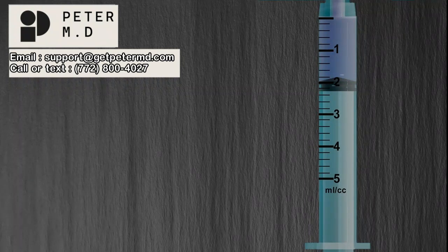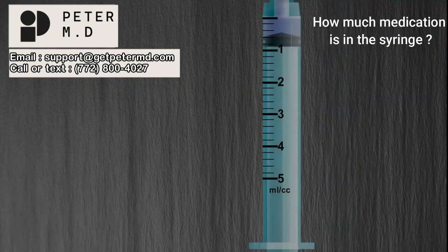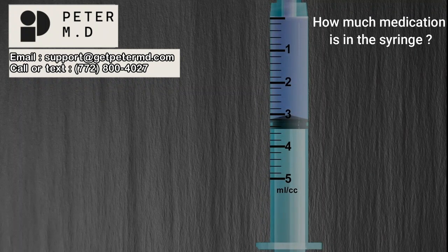When observing the stopper, you will notice that there is a bit of a cone shape at the tip. Ignore the cone-shaped area and measure the amount of medication by focusing only on the top ring of the stopper. For example, notice the top ring highlighted in red is touching the 2 milliliter line — this indicates that the syringe contains 2 milliliters of medication. How much medication is in this syringe? If you stated 0.6 milliliters, you are correct. One more — if you stated 3.2 milliliters, you are correct.